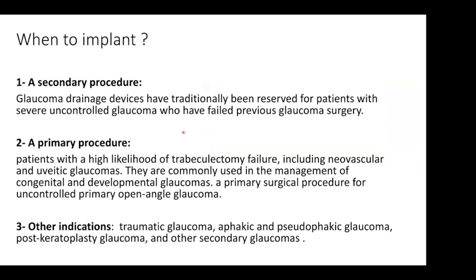Implants are basically introduced as a second procedure. It means that you have performed your initial surgery, like trabeculectomy, and then the trabeculectomy has failed and you can see a lot of scarring, so you will move to another step and go for that. So it's usually a second procedure, and it was introduced basically as a second procedure.